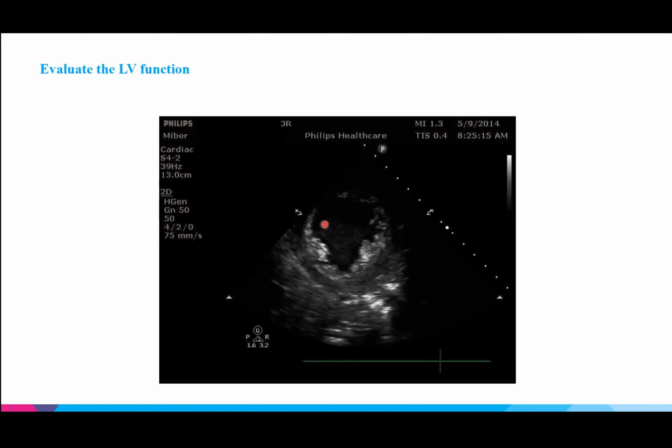And also, it's possible that maybe the left ventricle could even be dilated. I mean, it's taking up the entirety of the view. We're not even able to see the right ventricle. So this could be someone who might have a dilated cardiomyopathy, but I probably want to see a few other views too before I would say that for sure.